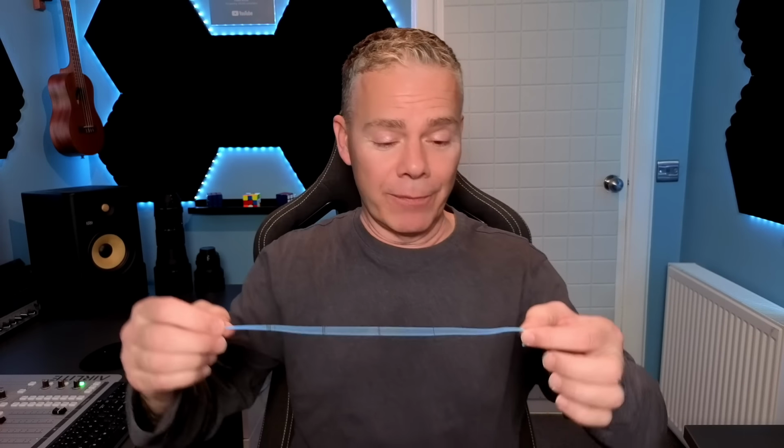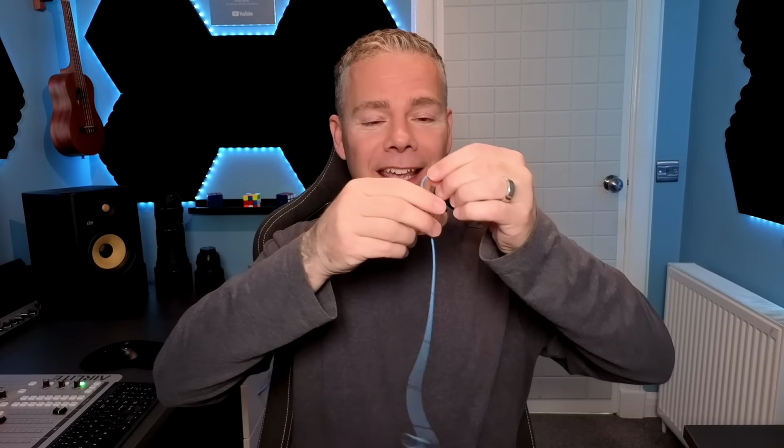After the surgery, he puts this stent into the ureter, which is that tiny little pipe between my bladder and my kidney. And you can see there's a little curl like a pig's tail at each end. So this part goes into the kidney and then the curl holds it in place. And then this bit runs down the ureter, the small pipe, into my bladder where there's another curl that keeps that in place. The reason it's there is to let the ureter heal because the pipe that connects the kidney and the bladder is very thin and it's very sensitive.